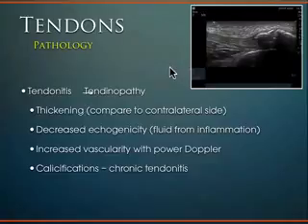What you're going to see on the ultrasound is just that fluid, that inflammation, that swelling around the tendon. As opposed to that, with tendinopathy or chronic tendon problems, it's going to be more thick tissue, disruption in the actual tendon tissue and architecture. There's going to be thickness, and changes in the echogenicity in the tendon itself.